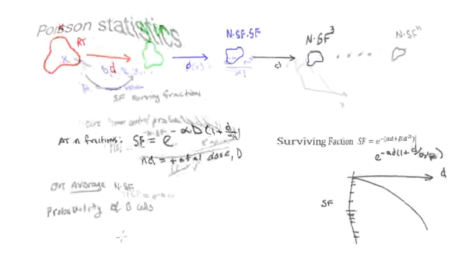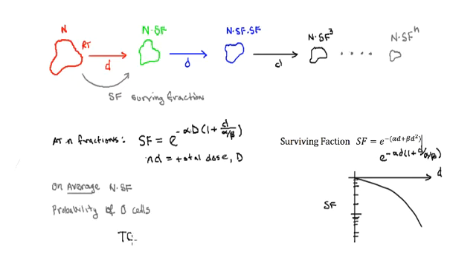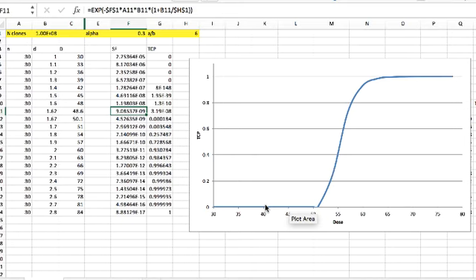So let's go back then to our previous study here. So the TCP then is equal to just this simple formula. Okay. And I could write it out if I want. It's going to give me a double exponential, which is this formula. Oh, sorry, I left the N, big N, out, but anyway, it's in there. So okay, so it's a double exponential.